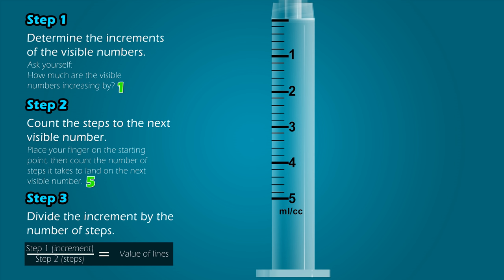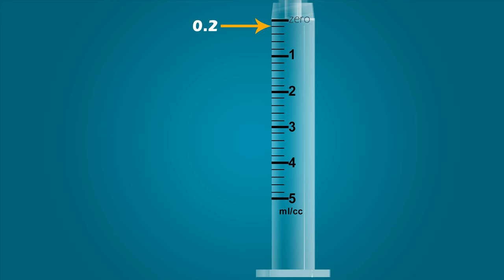Step 3: Divide the increment by the number of steps. All you need to do is divide the answer from Step 1 by the answer from Step 2. When the increment of 1 is divided by the number of steps, 5, it equals 0.2. Therefore, each line on the syringe represents a value of 0.2. That means this line indicates 0.2 milliliters, this is 0.4, 0.6, 0.8, 1, 1.2, 1.4, and so forth.